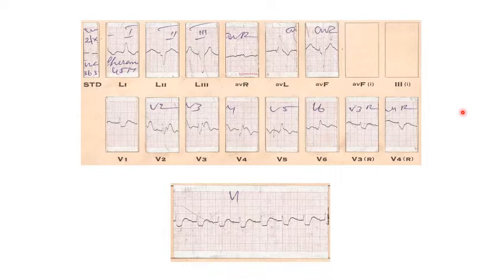But another criteria, somebody was telling about, what about the width of the QRS complex? QRS duration more than 140 milliseconds, I think, sir. No, it is 150. People have said 150. Because in a standard LBBB, sometimes you can get up to 140. So if it is 150 or more, that usually indicates associated LBBB with left ventricular hypertrophy. Okay, right. Yes. Go ahead, Saroj.